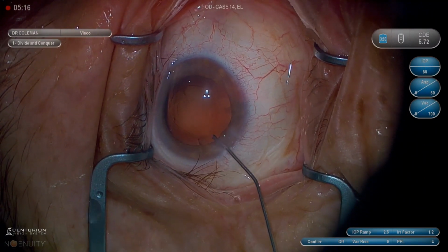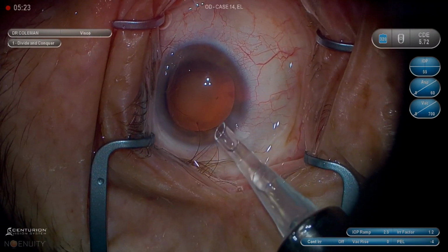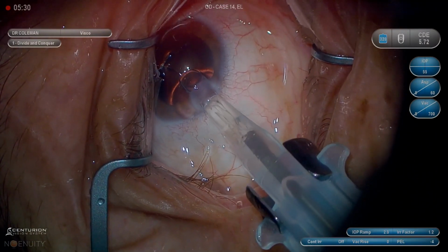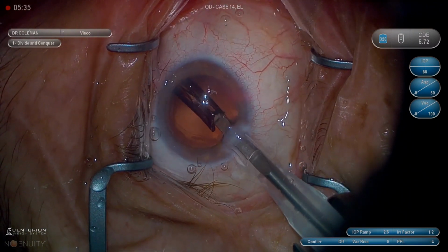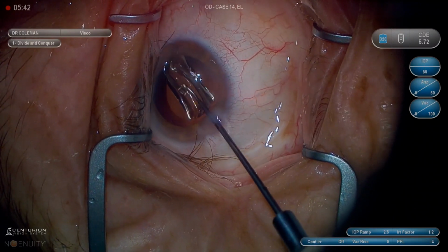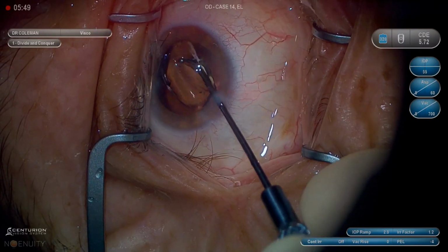Okay, so we're filling the anterior chamber, capsular bag, bevel up. Try to get the bubbles out of the end of the cartridge before I go in, so I don't end up with a big bubble sitting right in the middle of my view. I'm going under the anterior capsular leaflet, making sure it's there. Again, the Connor wand, I think it's the most versatile instrument ever made. Handles the lens just fine. Pushing it into the posterior chamber, letting the haptics fold out slightly. It's important not to load the lens too long before you put it in, or it'll take a long time to unfold, especially if your OR is cold.